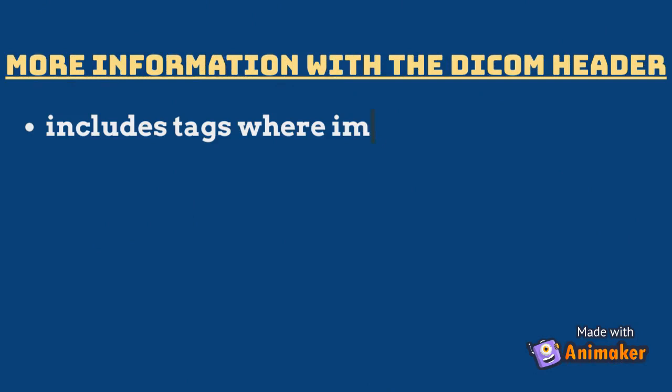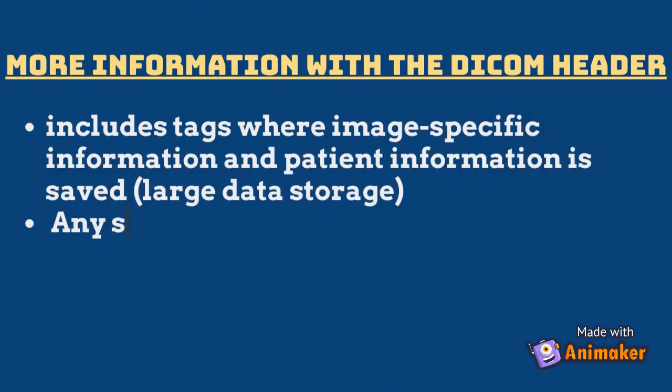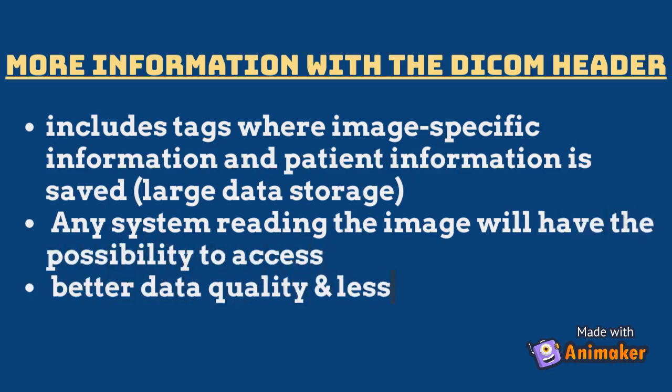The other advantage is that more information comes with the DICOM image. It is because the image produced includes steps where image-specific information and patient information are saved, as DICOM has a large data storage. Plus, every system that reads the image has the possibility to access the data, so the data can be transferred easily with better quality and fewer errors.